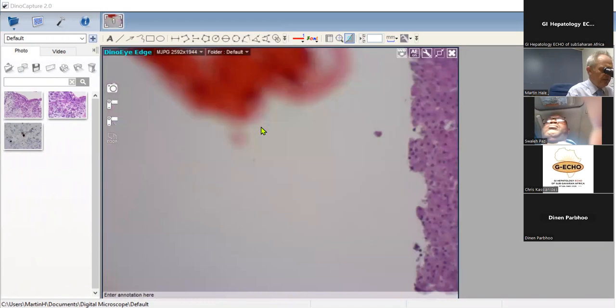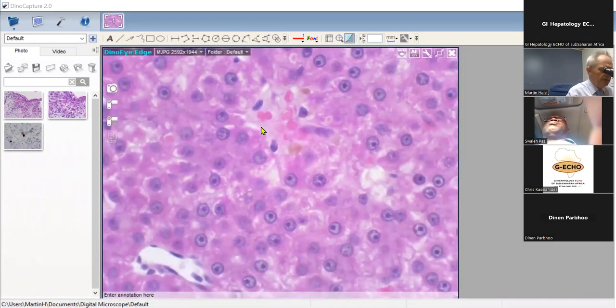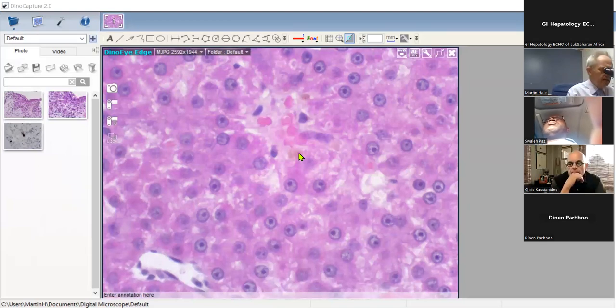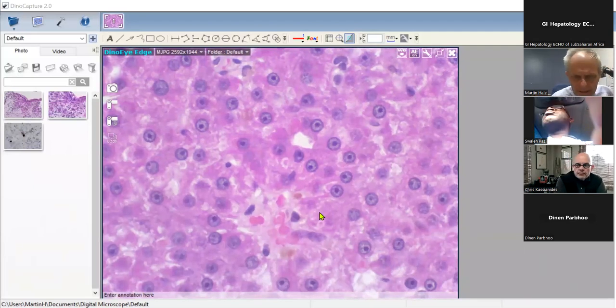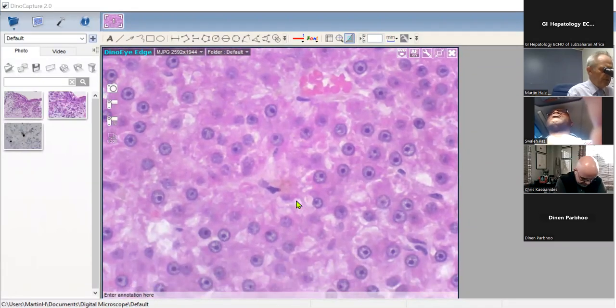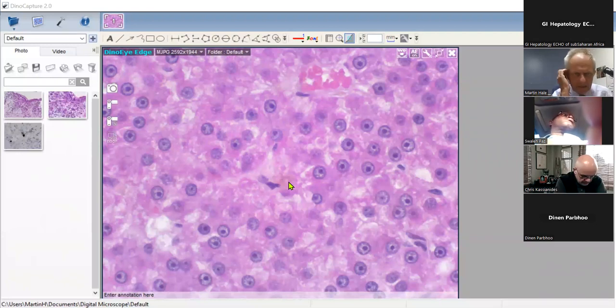Now, I mentioned to you that if you're lucky, you can also find bile in these cells. And if we look at this here, we can see that we've got intracellular bile, for example, that cell there. And there is also bile in the intracanalicular pattern, that's intracanalicular there. And for example, I think here you can see this greenish brown tinge, which is characteristic of intracellular bile. So that's a dead giveaway.